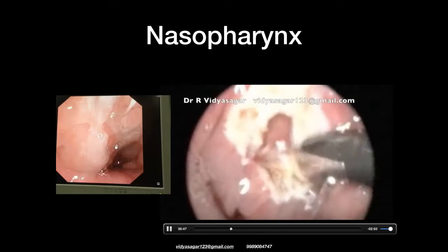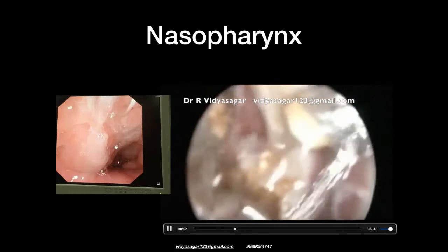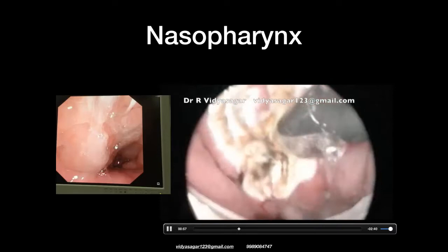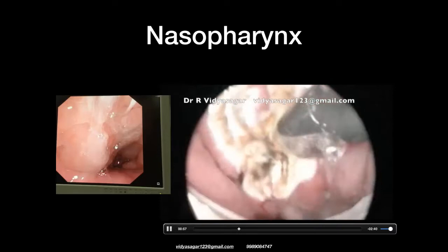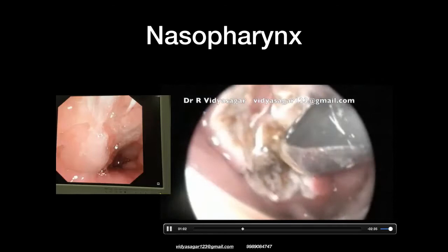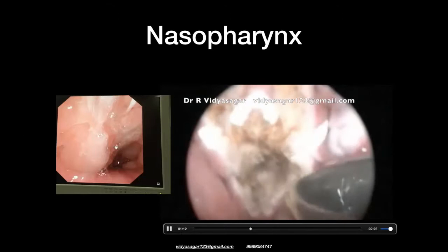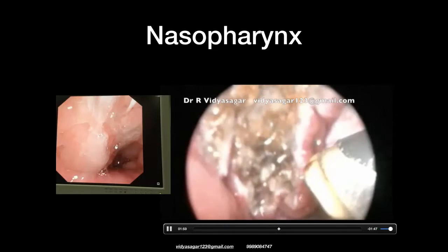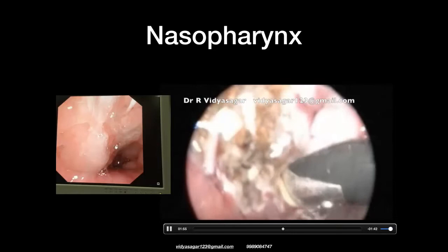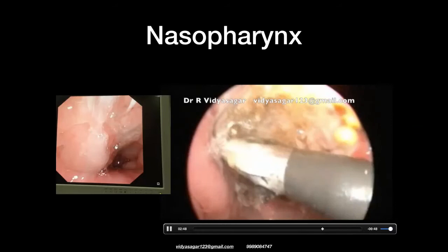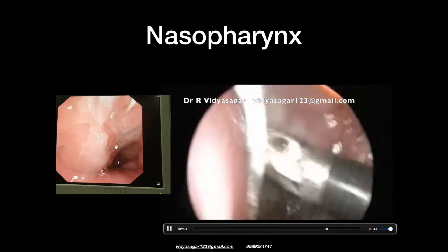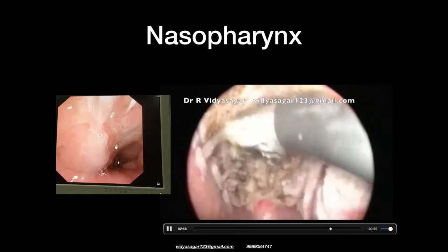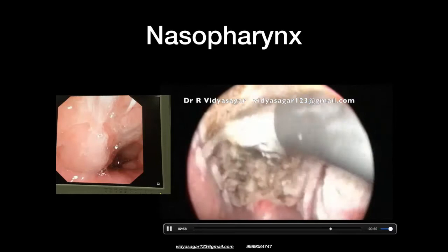We found the lesion adherent to adenoid tissue. Adult adenoid tissue — due to recurrent infections — undergoes fibrosis unlike pediatric adenoid, so it needed a lot more ablation. Using the Precise Easy View wand, we ablated the rest of the adenoid tissue and as we went toward the buccopharyngeal fascia we ablated completely so it would not recur.